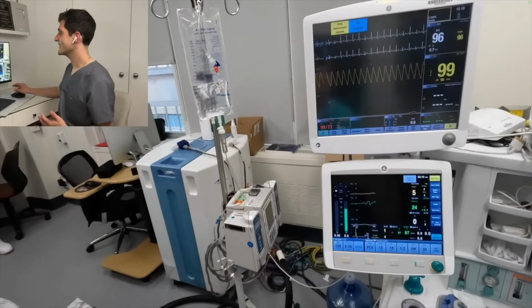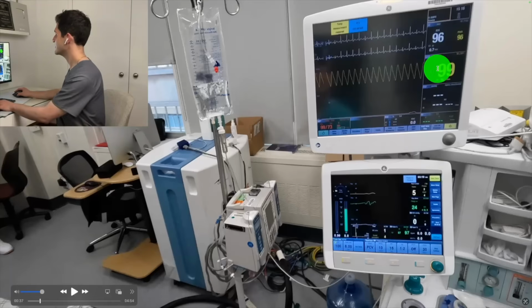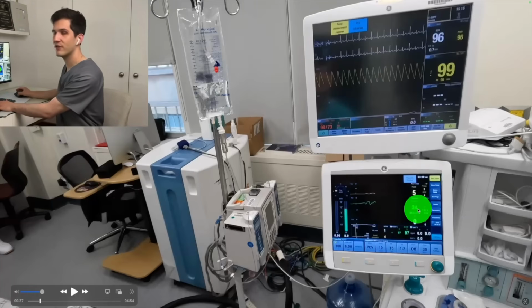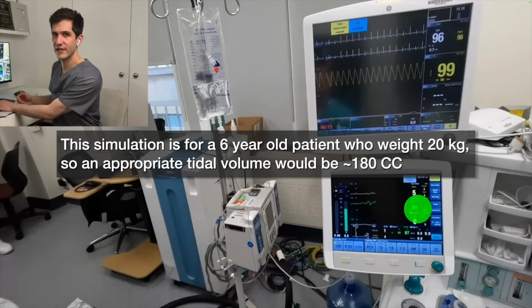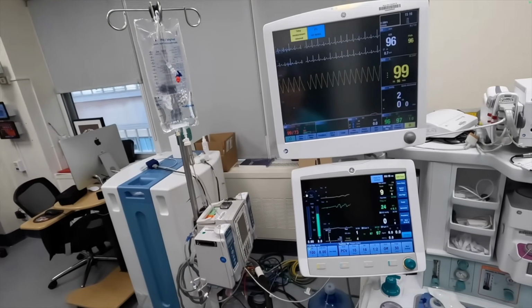So as I'm going through this process, I'm talking with the patient, but I'm also taking a look at their vital signs. From top to bottom here, you can see their EKG rhythm strip, their heart rate is 96, their oxygen saturation is 99, and I'm also looking at the anesthesia machine at the size of the breaths that the patient is taking. And I had them start breathing just now, so we don't have a very good tidal volume, that's 24 cc's. So I'm going to encourage the patient to take large breaths to really fill up those lungs with oxygen, as we get ready for a trip to outer space.